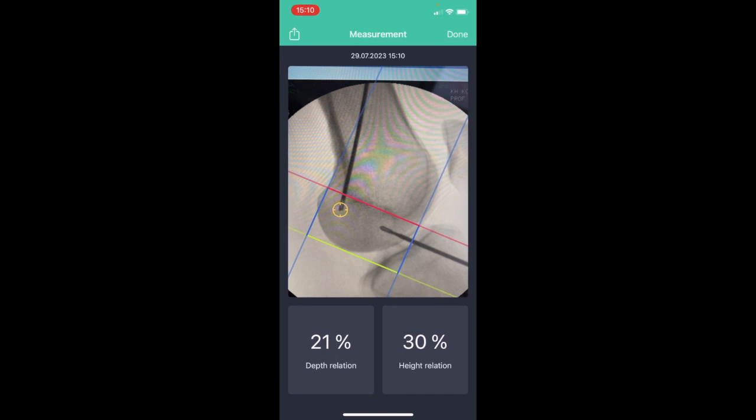And here we go. We got the result. We have a 21 percent depth relation from the posterior edge and 30 percent for the height relation from Blumensatz line.